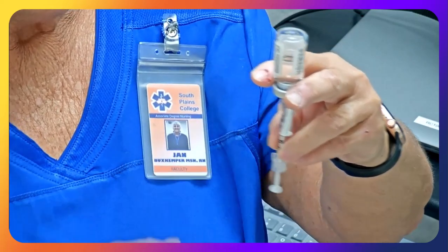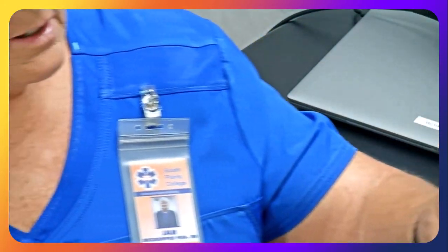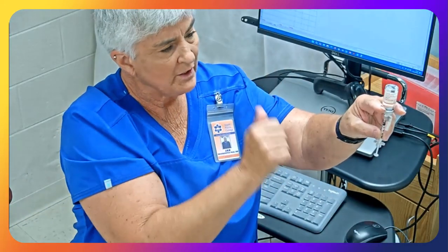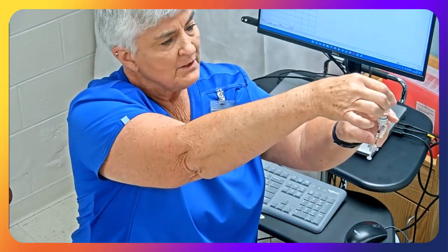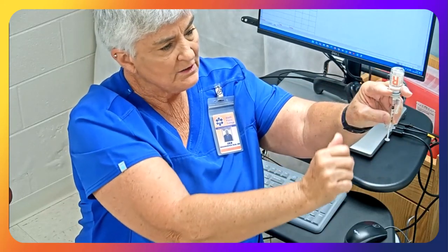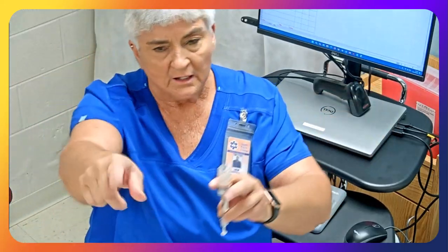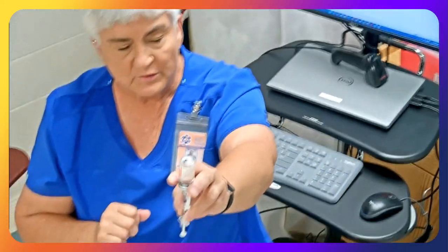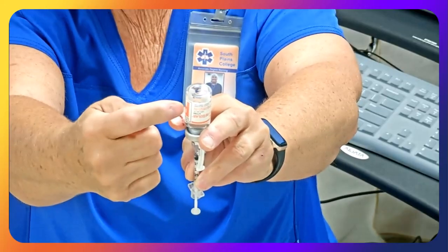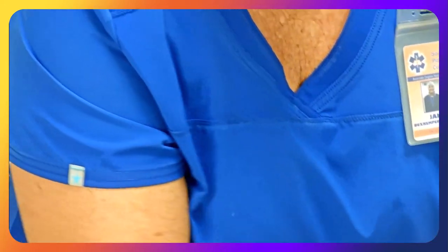Okay. Then I have to have 2 licensed personnel verify, so they tell me what you see. They should tell me they see regular insulin and it is 8 units. And so that matches what I'm supposed to have. I'm going to get a second licensed personnel. What do you see? They should tell me they see regular insulin, 8 units. So that tells me I have the correct amount.